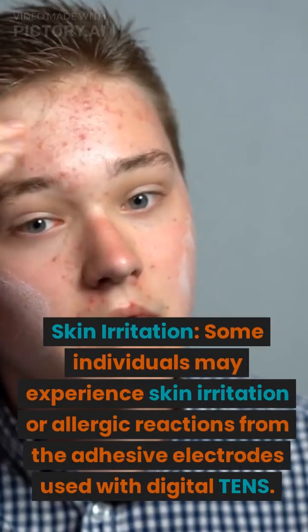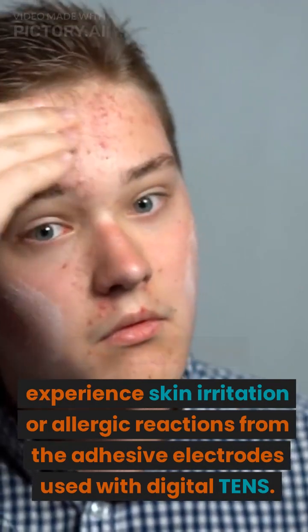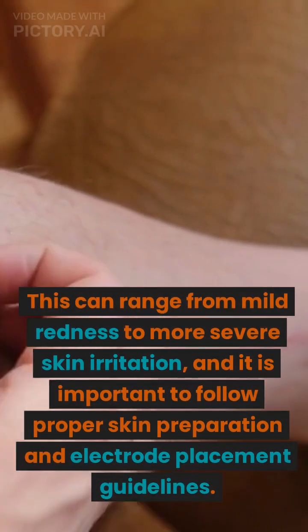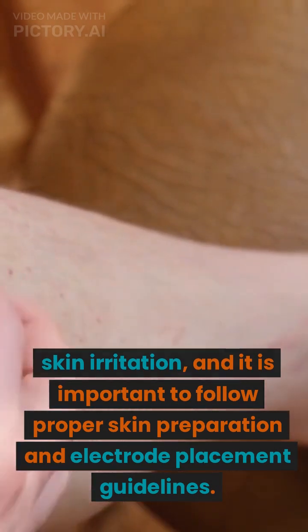Skin irritation. Some individuals may experience skin irritation or allergic reactions from the adhesive electrodes used with digital TENS. This can range from mild redness to more severe skin irritation, and it is important to follow proper skin preparation and electrode placement guidelines.